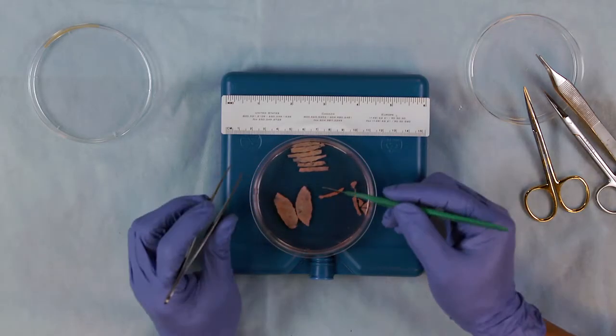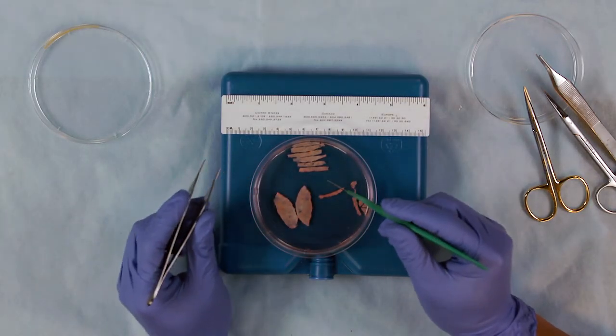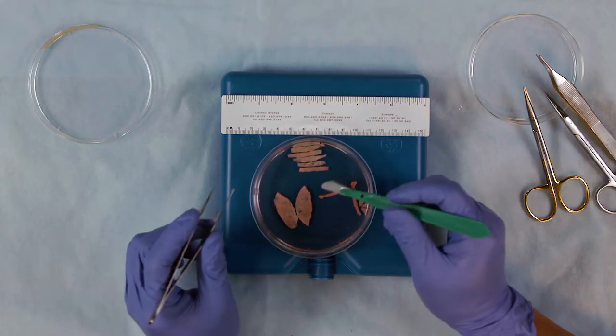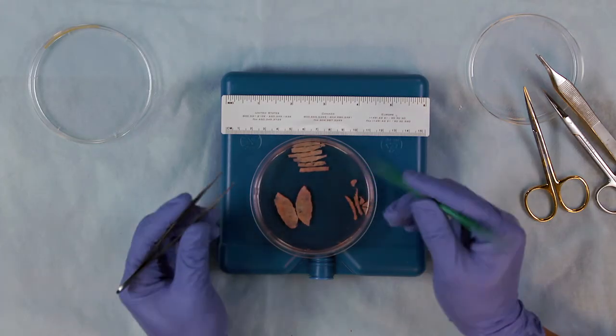If there are pieces that are smaller, put them aside as they are good pieces to allocate to the 20% research portion of the study if the patient is participating.